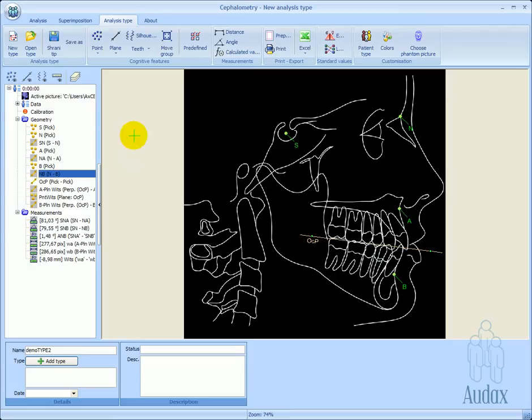The definition of an analysis type is concluded by assigning normal values to the measurements.